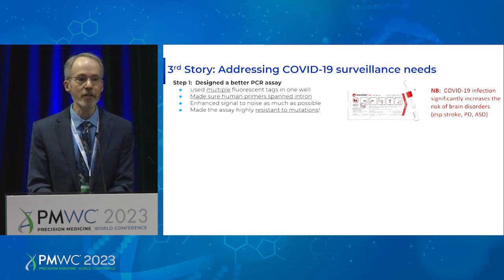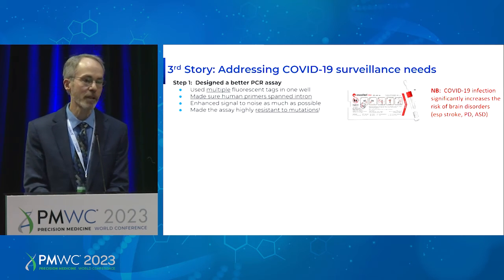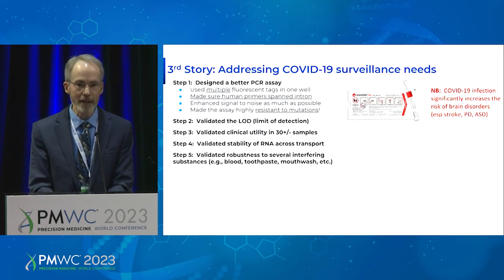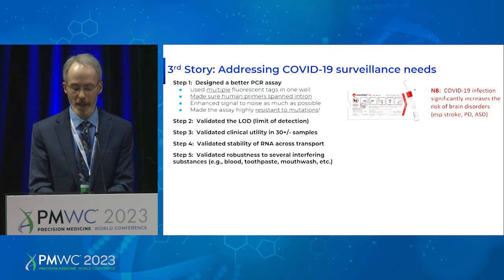We also made use of the swabs that you heard Scott mention at the very beginning, because they not only stabilize the RNA, but they also inactivate the virus and many other viruses so that we could use the fluids in pool testing development without exposing the lab workers to hazardous potential threats. So we validated the sensitivity. We went through the whole steps and procedure to receive FDA emergency use authorization.